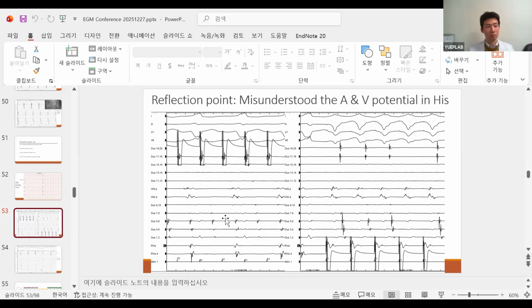Yes, yes, yes. Another tip is to use the duodecapolar catheter the first time. The duodecapolar catheter has multiple electrodes, so you can map the right atrium. You don't need to place the CS electrode deep inside. Pull back a little bit with clockwise rotation, and you can map even the anterior tricuspid annulus. Because a young patient has a D-shaped tricuspid annulus, unless the patient has RV failure, you can manipulate the duodecapolar catheter and map a more clear location of the bypass tract relatively easily.